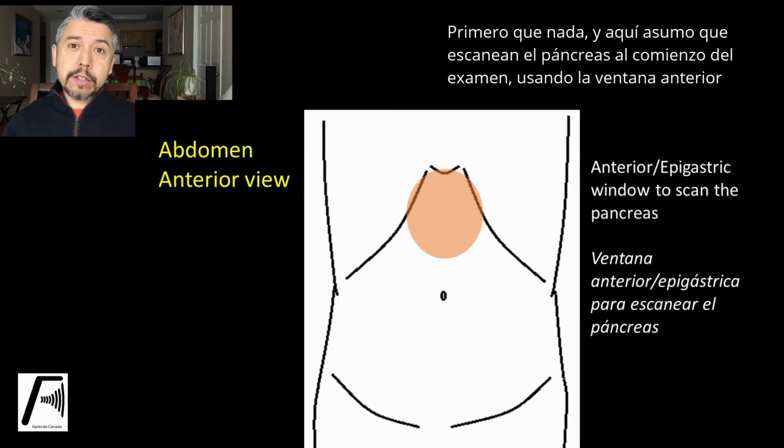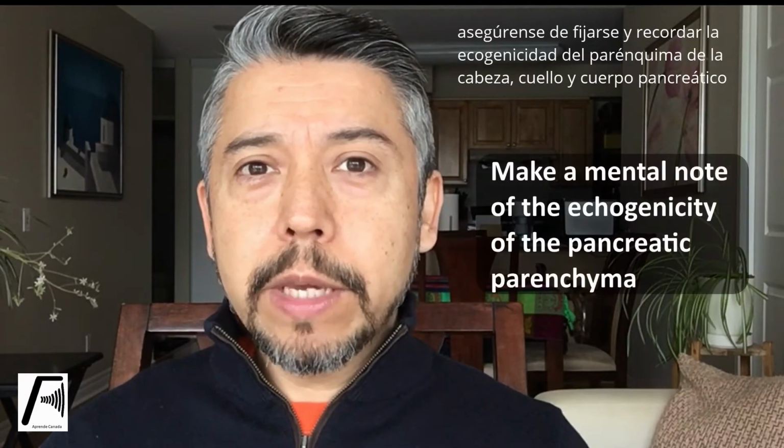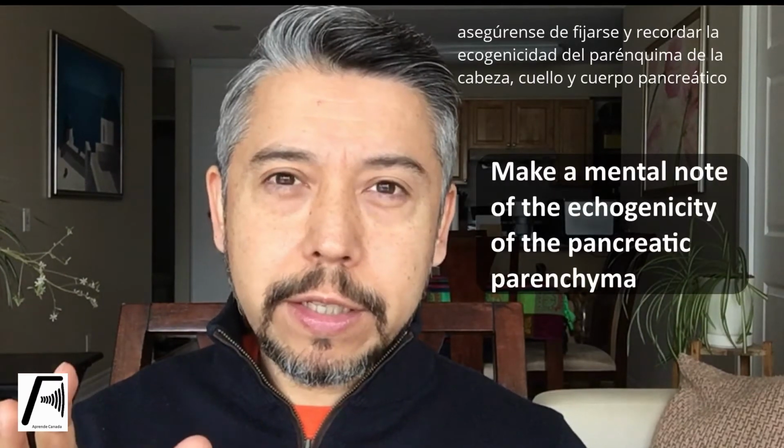So first of all, when you're scanning the pancreas, make sure that from the anterior window, at the start of the examination, and I'm assuming that you will be looking at the pancreas from the anterior window first, when you find the head, the body, the neck, you remember the echogenicity of that pancreas.